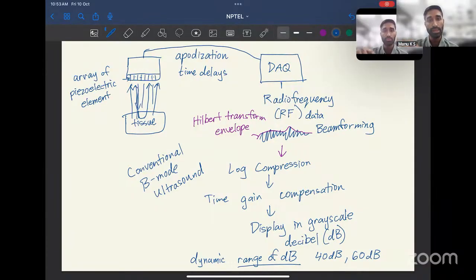That's one way a peak of a waveform can be detected, and that's in a way what the Hilbert transform also does. But it's more like a DSP processor. So you'll have a digital signal processing board which will be doing all this compression, transforming, and everything. But if you want to completely do it in hardware, that's also possible using these peak detection circuits.